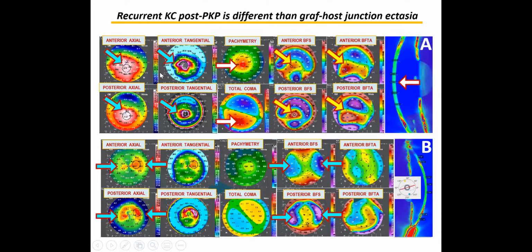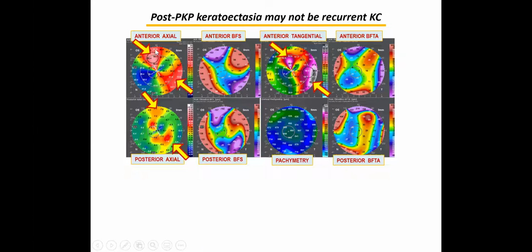This is an extremely toric cornea after transplant, okay? And usually the pattern is this. You can see where the steeper cornea is, actually is the lower elevation, it's not the highest elevation, there is not a lump, okay? And there is actually thick cornea there.